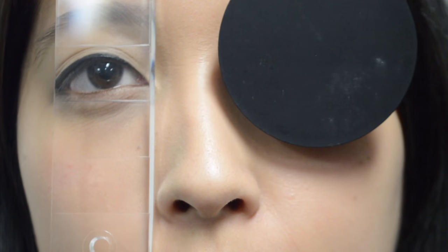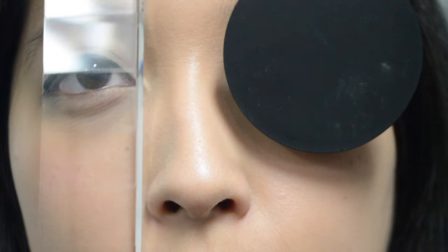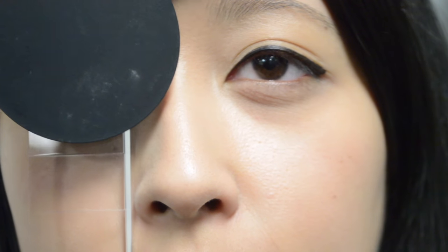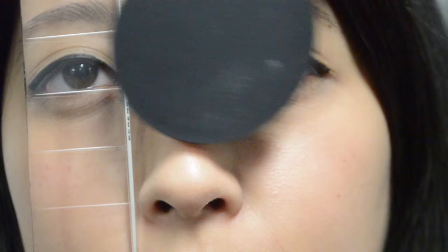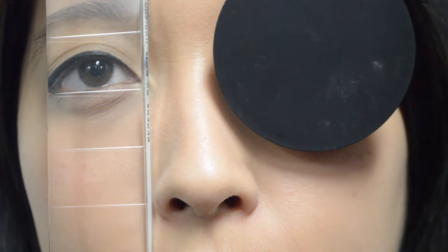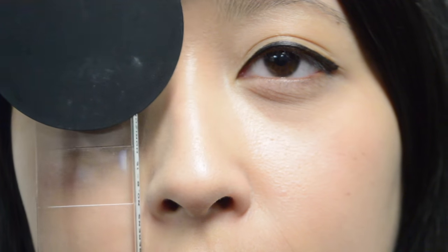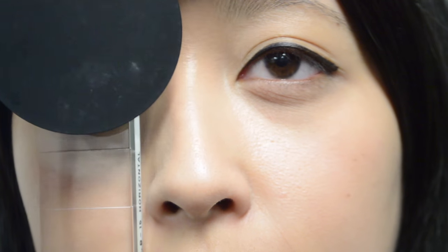The PCT utilises the alternating cover test, observing the eye movement under the prism. By using the prisms, the image of the fixated object is brought closer to the fovea, which leads to a decrease in eye movement. The strength of the prism is increased until no movement is seen, which is the null point.